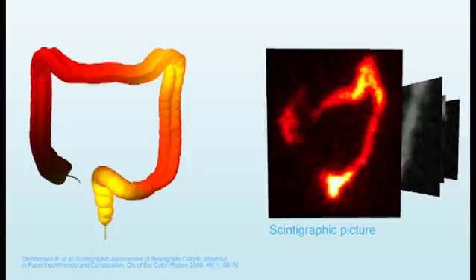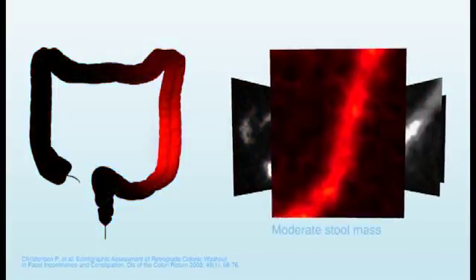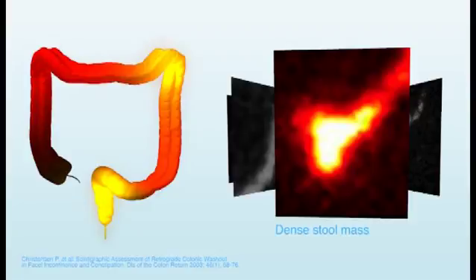The fecal matter has been traced using radioactive markers. You can see that there is a large amount of fecal mass throughout the descending colon and in the rectum, denoted by the bright yellow color.